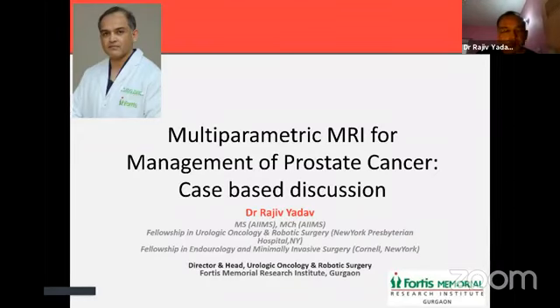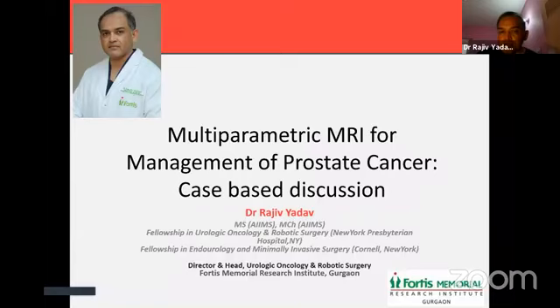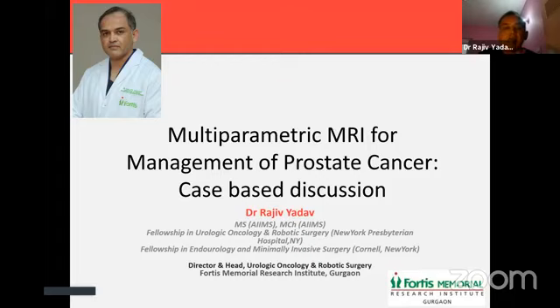The topic was to make the reading of the MRI a little bit simpler. I can tell you it is simple, it is not that complex. The only thing is that we do not have a habit of seeing the MRI ourselves, just like we did use CT scan in day-to-day practice. And that's what makes some people believe that reading MRI is a little bit difficult.